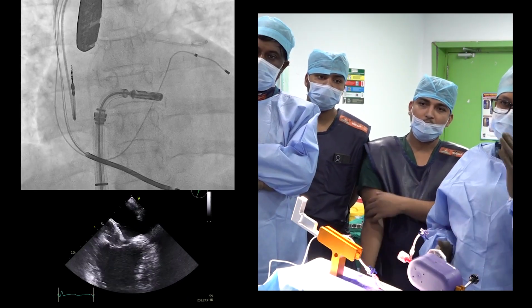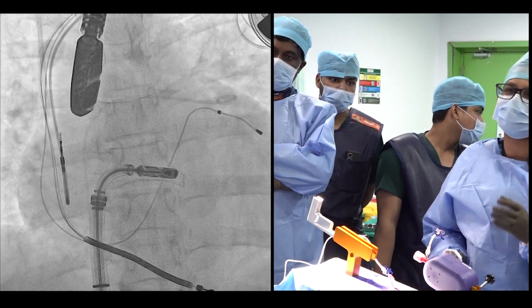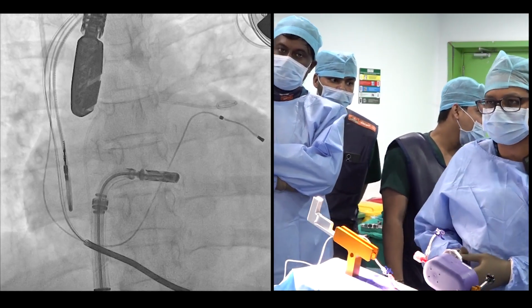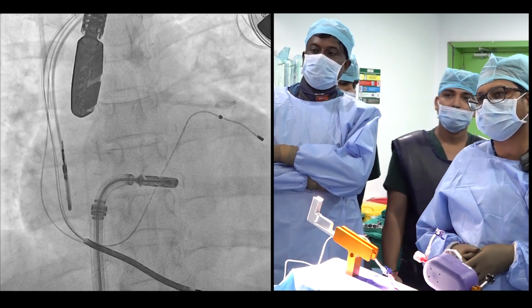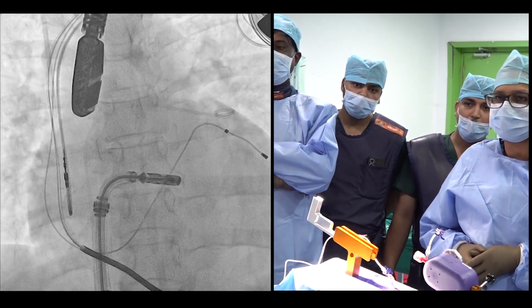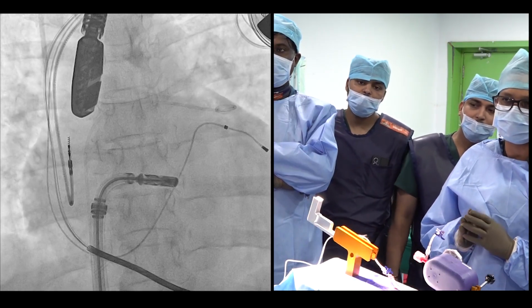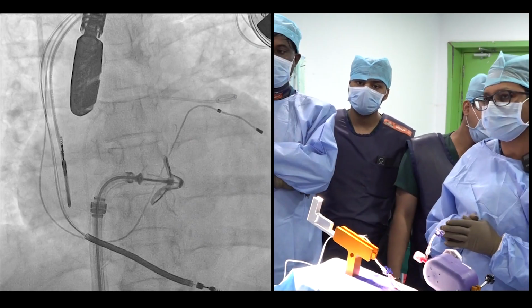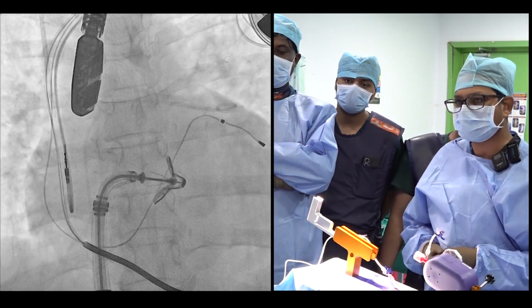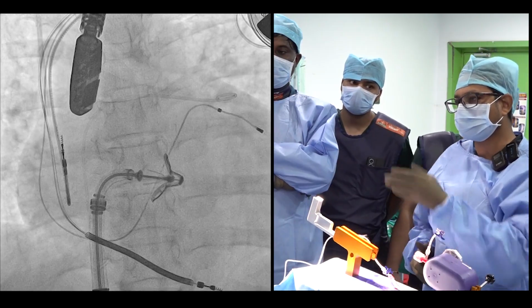In the bicommissural view, we can assess the medial and lateral position of the MyClip, and in the LVOT view we can assess the anterior and posterior position of the MyClip. The idea is to keep the MyClip in the center with the arms open. We open the arms and place the clip above the level of the mitral valve, which you can appreciate in the fluoroscopy.